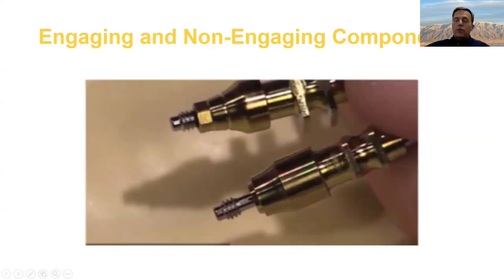Keep in mind that some restorative components can only be purchased as non-engaging, including the parts that interface with many multi-unit abutments.